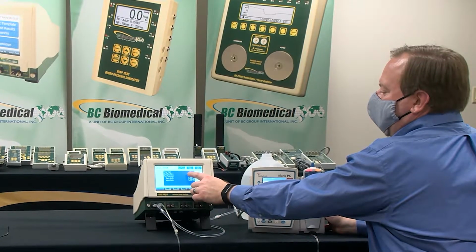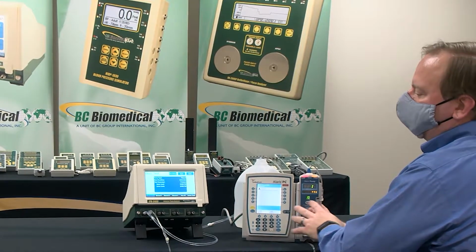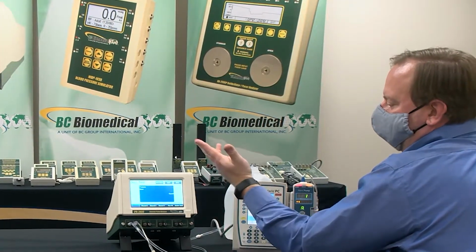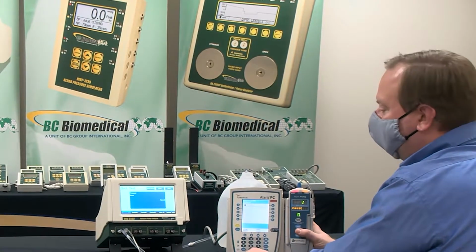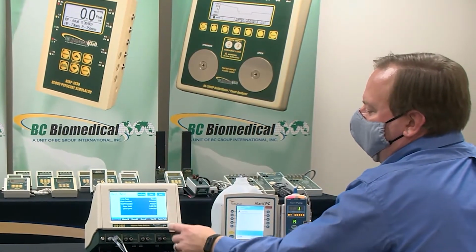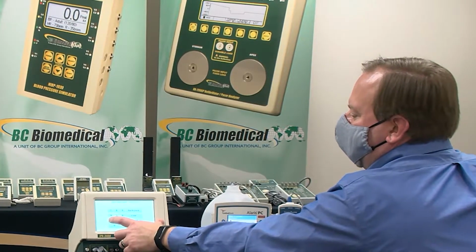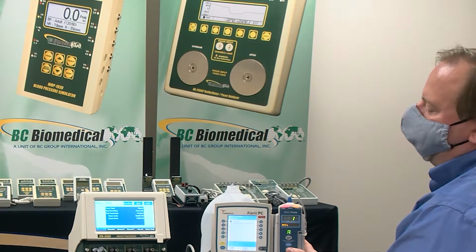Start condition, automatic, same kind of thing with the flow test. The timer either starts when I hit start or it starts when it sees pressure. So I'll leave it as automatic, so it starts when it sees pressure. And then our test parameter is, we can either measure pressure, and this is for the pass-fail condition. Pass-fail is either based on pressure or none, because we don't have any other options, it's doing occlusion. So if you're going to measure based on pressure, then what is your tolerance? So we want to say, don't be over 10, and you gotta be at least 5 PSI.